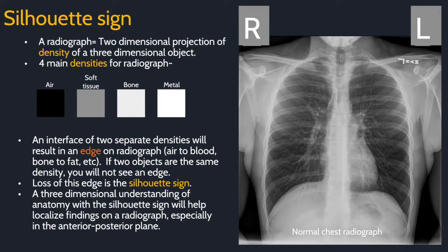When looking at a radiograph, one of the most important concepts to understand is the silhouette sign. Remember that a radiograph is a two-dimensional projection of density of a three-dimensional object. White is more dense and dark is less dense. Here are the four basic densities of a radiograph: air, soft tissue, bone, and metal.